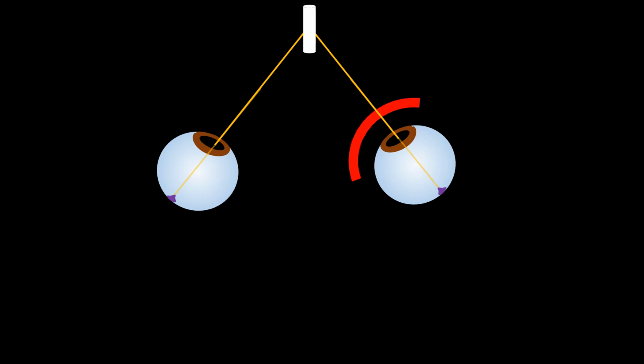As the patient is looking through the goggles used for bar diplopia testing with the red crystal on, the right eye will capture the red bar at the fovea, and since the left eye is looking through the green crystal, a green image will fall in the left fovea. I am now representing the anterior segment of the optic nerve fibers corresponding to the area of the fovea imprinted with the images of the bars.